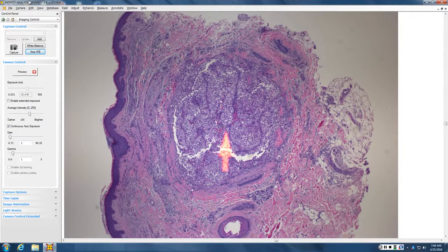There are lots of blood vessels with erythrocytes between those tubules. So we had one fellow who used to, in a British accent, say it was a bloody renal cell carcinoma, just to help the residents remember that they tend to be bloody and glycogenated. And then they're CD10 positive, and there's RCC and some other markers that can be used to confirm.